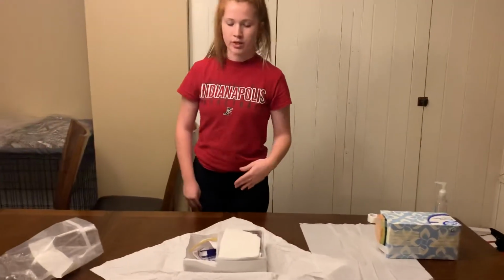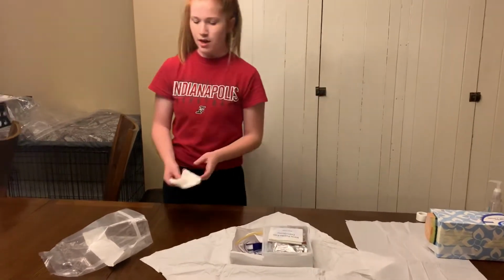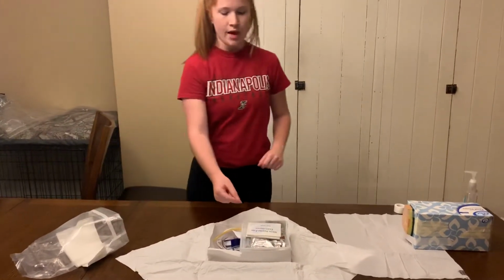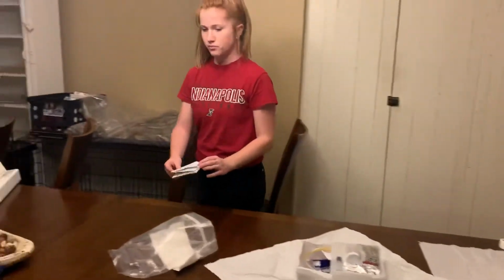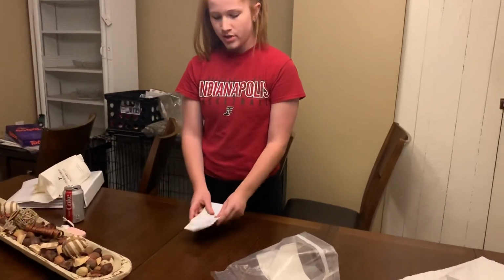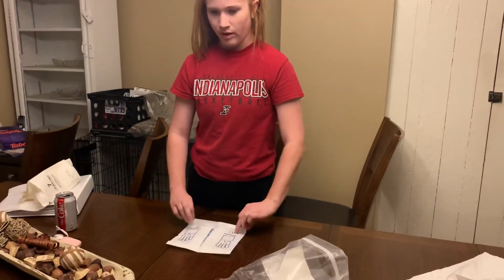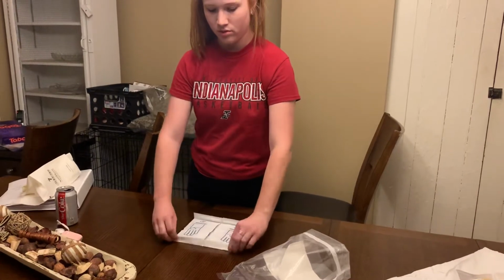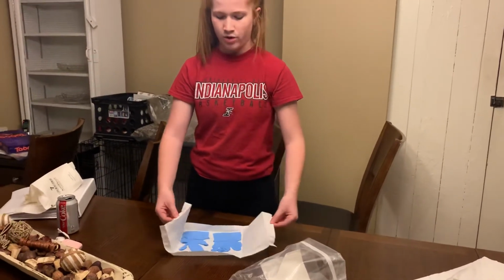Next, I'm going to get rid of this drape because I will not be using this today. And then I'm going to grab my exam gloves and I will be putting those on. So I'm going to start by opening the package. Lay my flap down. And opening the gloves, all just touching the outer border.